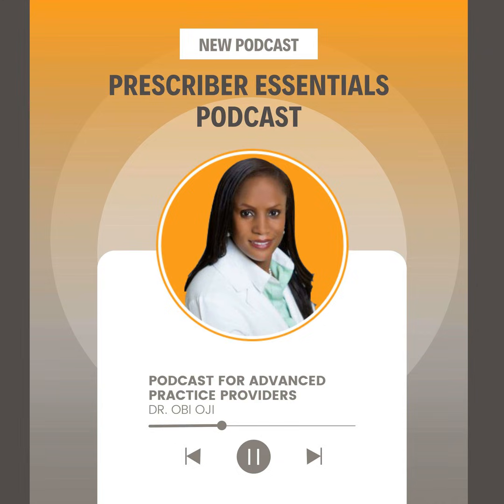All right, so now 10 minutes is over. So I'm going to have to ask the patient, Ms. Jones, do you feel any pain or pressure? Just pushing down on the abscess, and hopefully the patient is nice and numb. You want to go directly on the abscess itself because that's where you'll be making your incision. So right here, do you feel any pain or pressure, Ms. Jones? And the patient says no.